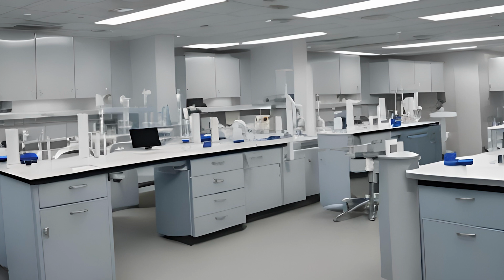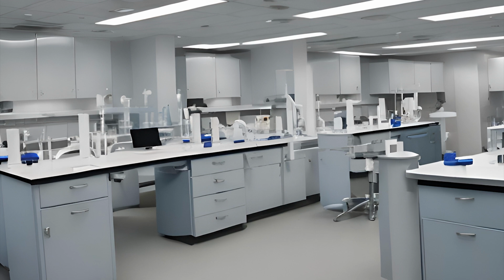Hemolysis will most often occur from using too small of a needle to collect a specimen, when someone mixes tubes too quickly or forcefully, shaking the tube instead of gently inverting it, or improperly filling the tubes. If somebody collects a big syringe full of blood and then squeezes it out into the tubes sitting on the countertop really fast under a lot of pressure, that can also hemolyze the samples.